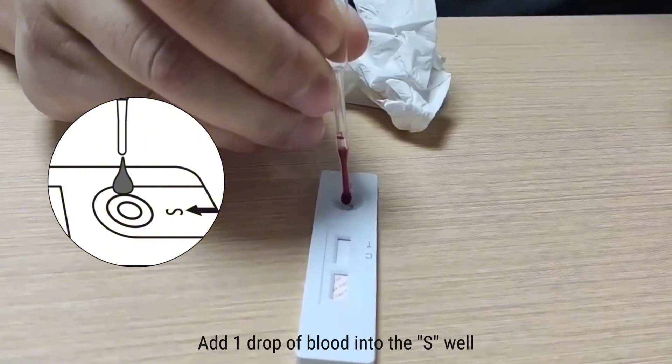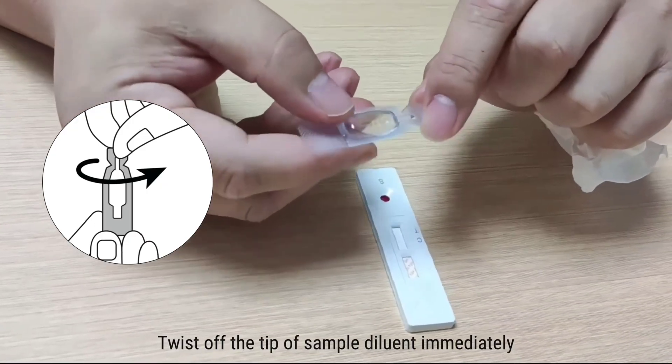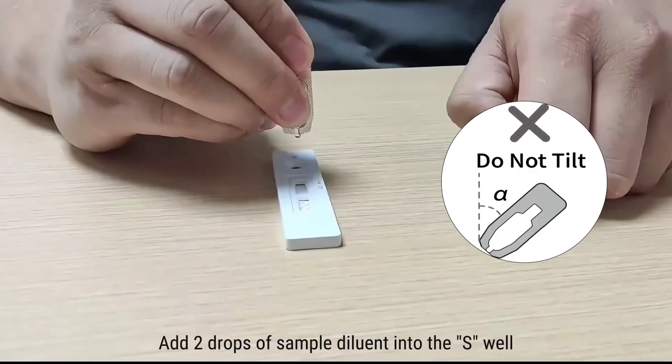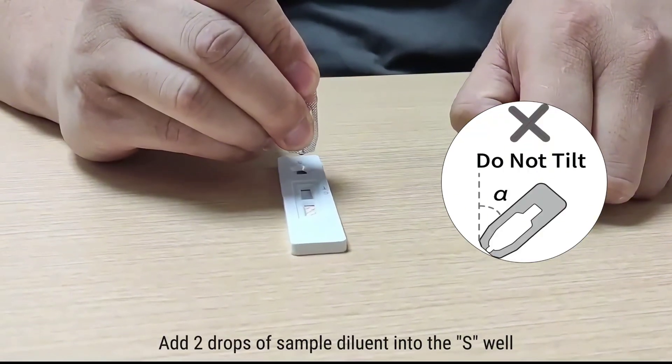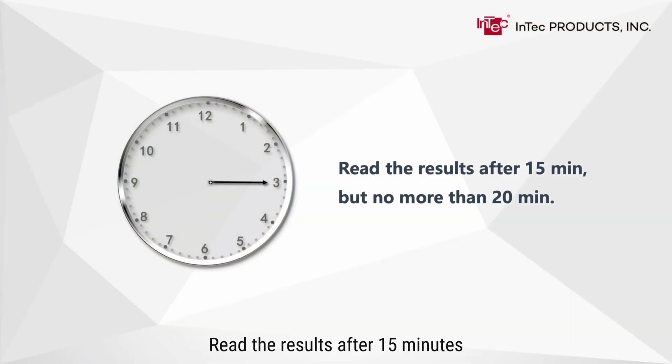Gently squeeze the dropper bulb and add one drop of blood into the S well. Twist off the tip of the sample diluent and immediately add two drops of sample diluent into the S well. Start timing and read the results after 15 minutes, but do not read the results after 20 minutes.